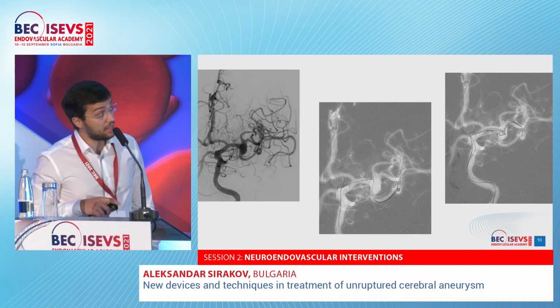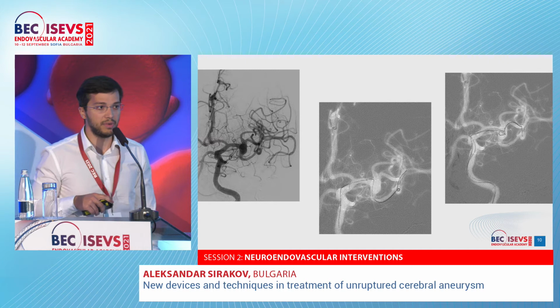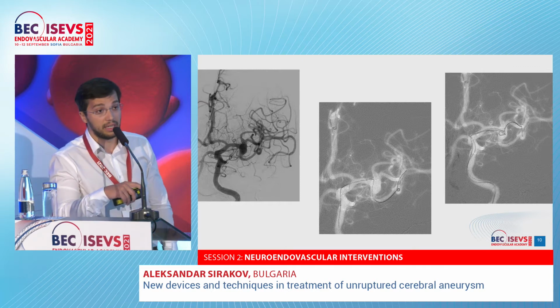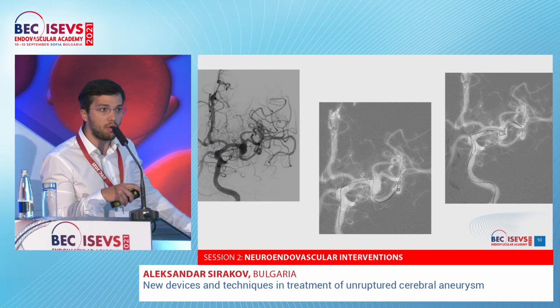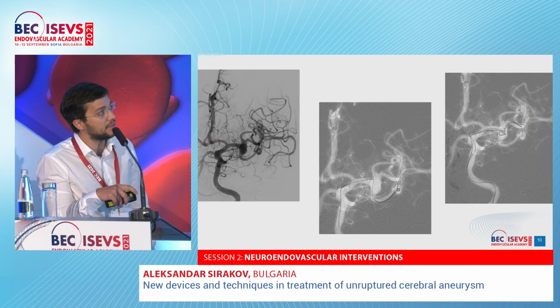Another challenging case, in my honest opinion, that's an MCA kind of ugly aneurysm located at the level of trifurcation. What we did here is, I'm not gonna lie, we failed miserably 2 times to embolize this aneurysm with simple coiling or the assisted coiling with balloons or whatever. So we thought that it's a good idea to do Atlas in Y configuration. That's exactly what we did.